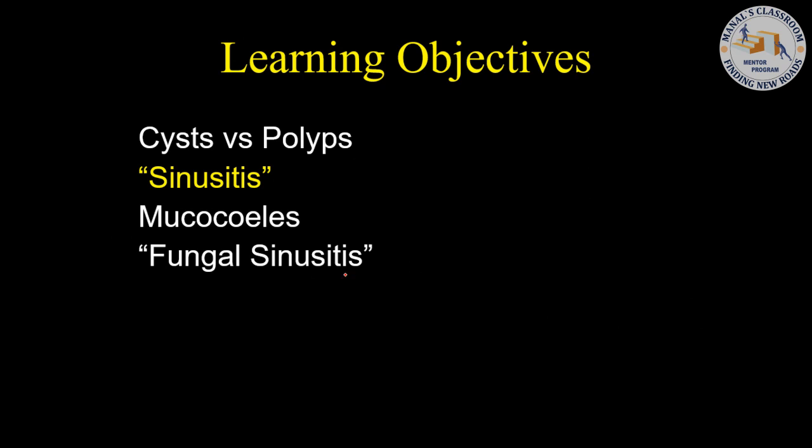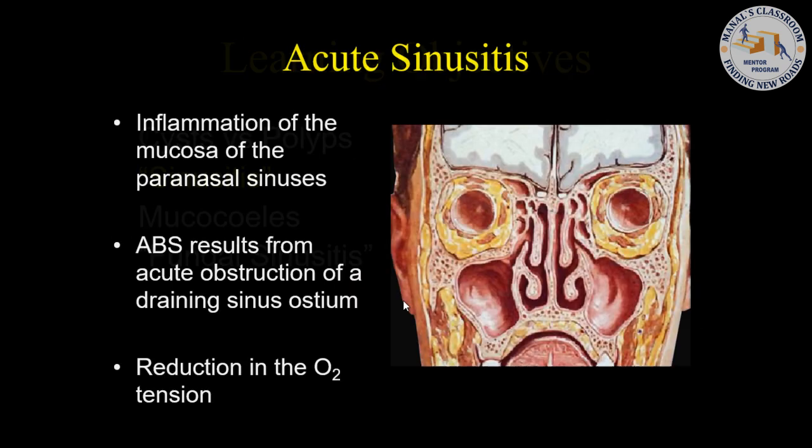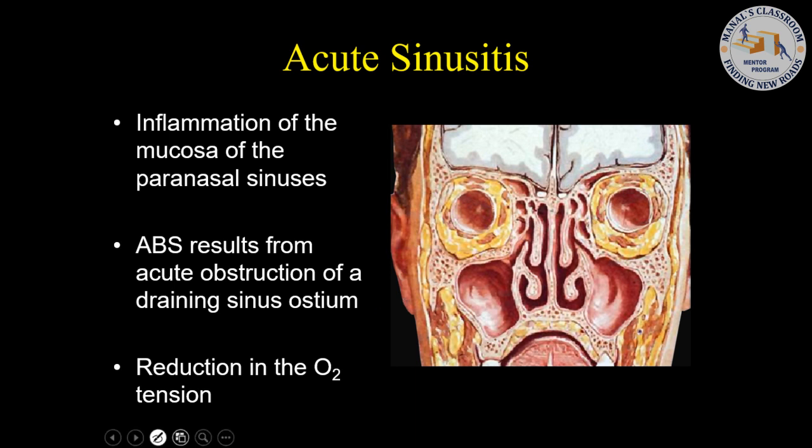Now let's talk about this disease entity called sinusitis. First of all, sinusitis is not a radiological diagnosis. It is a clinical diagnosis. So we'll look at a CT scan, and many people say it's sinusitis. It's not sinusitis. Our job is to define the extent of the disease.